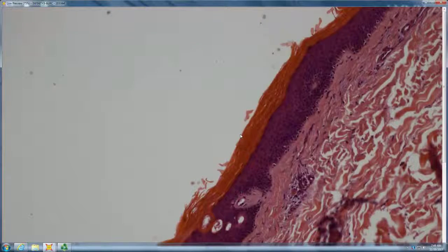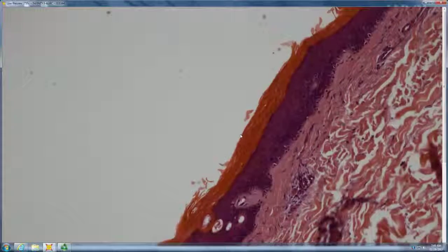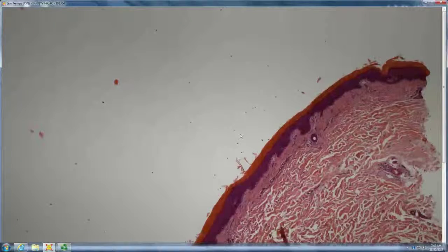The last one, with the very unimpressive corneum, but more lamellar, very thick, is more characteristic of X-linked. IV tends to be really red with no visible space, no visible lamellation between them. Distinctly absent granular. Your epidermis is not particularly hyperplastic because, again, it's a retention hyperkeratosis.